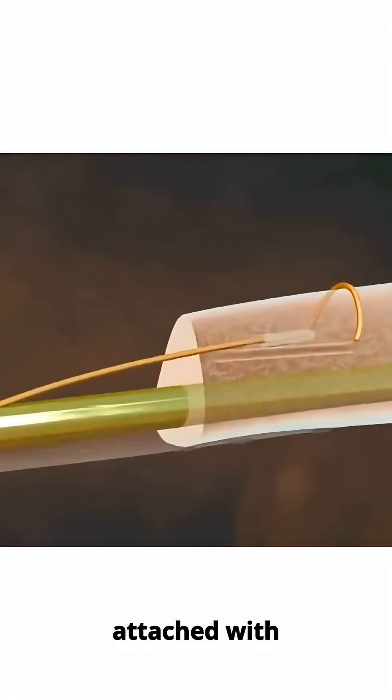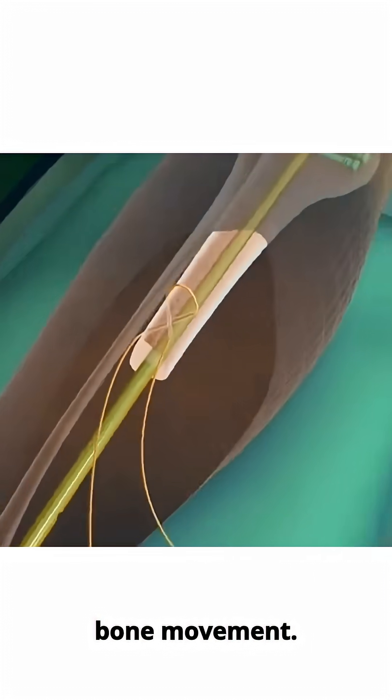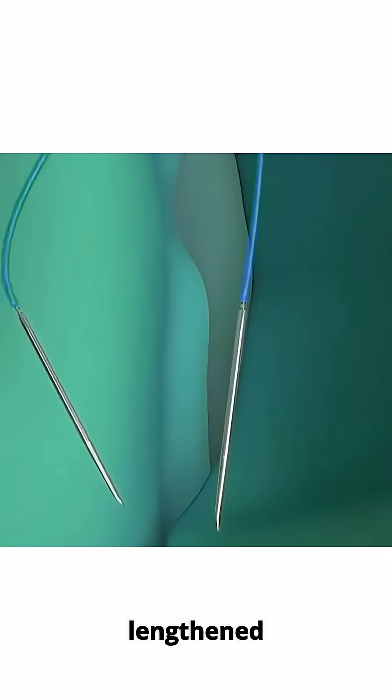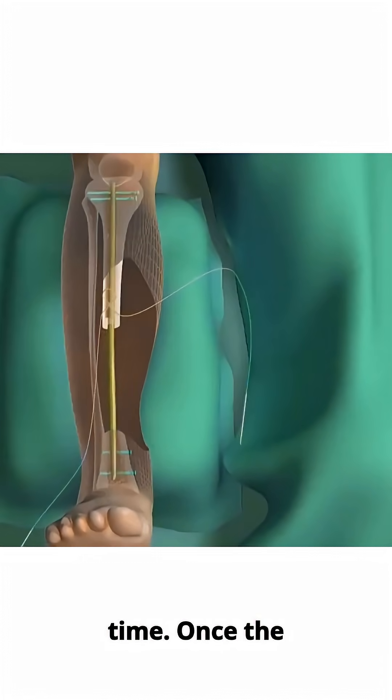A circular fixator is attached with pulleys to control the bone movement. Using the blue clickers, the bone is slowly lengthened 0.25 mm at a time.